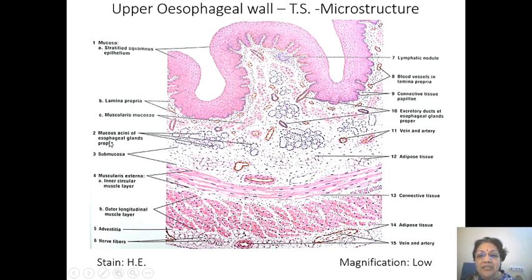is some glands. So in the esophagus proper, please remember the microstructure of esophagus, there should be some glands. These are mucus secreting glands. They don't take up much stain. You remember serous glands take up a good purplish kind of stain, like we saw in pancreas, or we didn't see pancreas yet, or we saw in parotid, right?